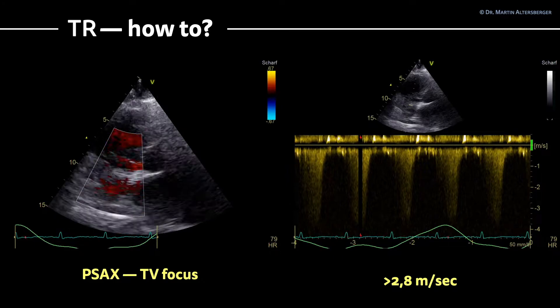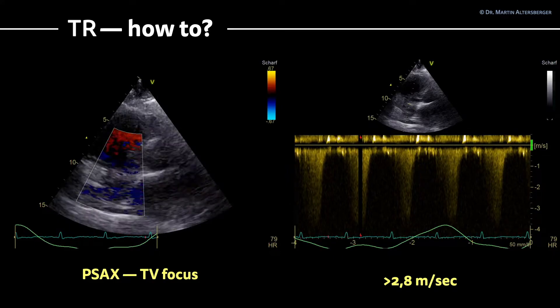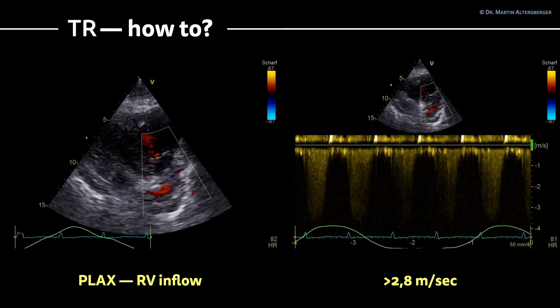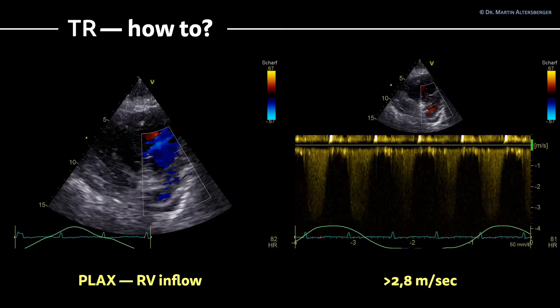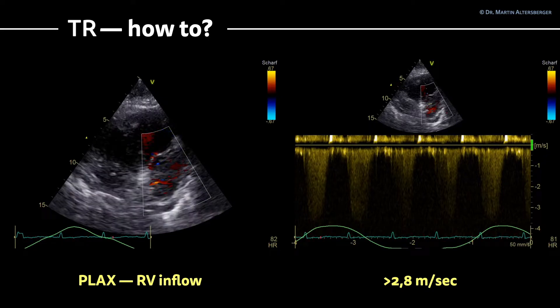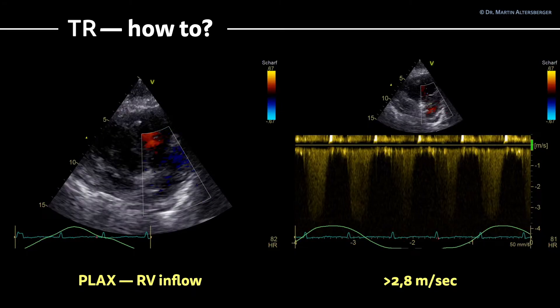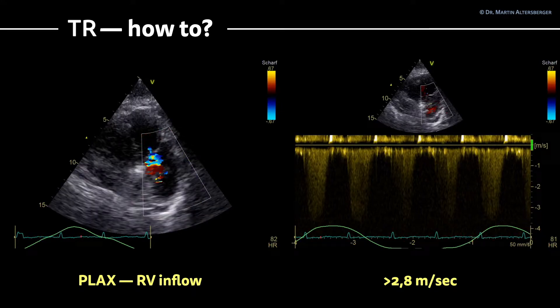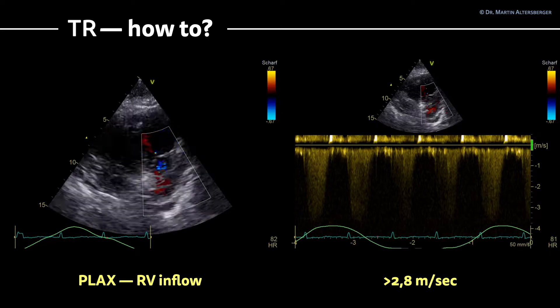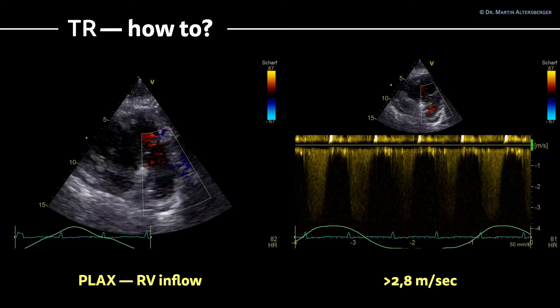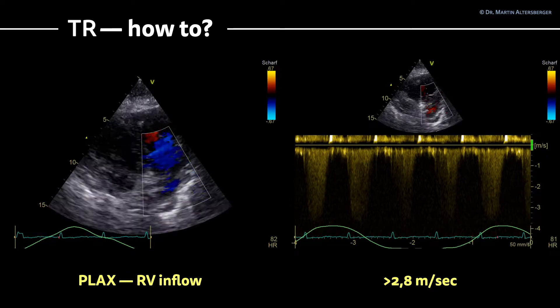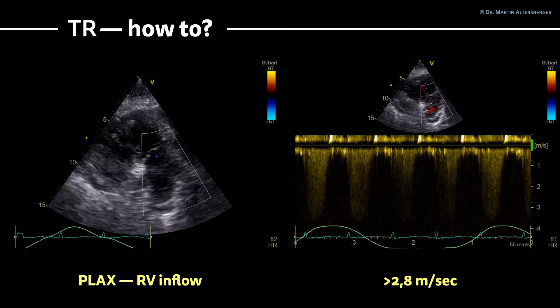If this also doesn't work, you can acquire another view — the parasternal long axis view. In the parasternal long axis view, you simply tilt the transducer down towards the right ventricle, and then you see the tricuspid regurgitation angulated optimally. Sometimes this is the best view to acquire an optimal signal. Using continuous wave Doppler here, you again see that the signal exceeds 2.8 m/s and is also in the range of 3.5 to 4 meters per second.